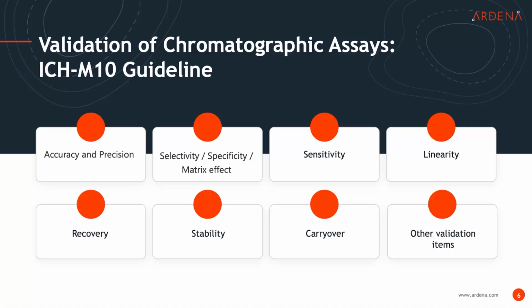Recovery and stability, assessing how well the analyte is extracted and how stable it remains under various conditions. And finally, carryover and dilution integrity, ensuring that high concentrations do not contaminate subsequent samples and that the diluted samples remain accurate.